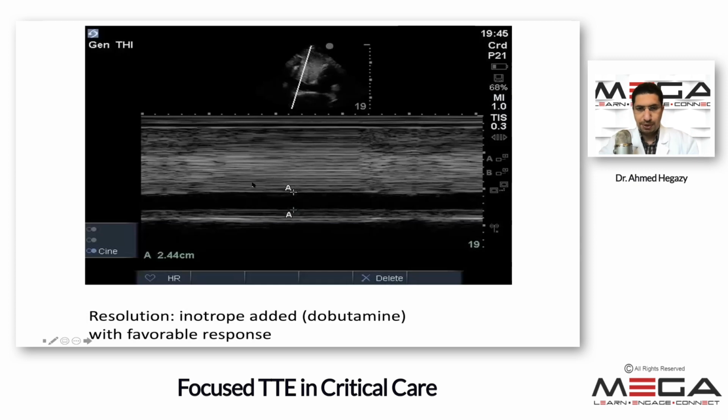So essentially this patient, instead of needing a vasopressor, instead of norepinephrine and vasopressin, needed an inotrope. His contractility was severely impaired. So we added on dobutamine. You could have probably added on milrinone as well. It would have worked just as well. We, in this case, added on dobutamine. And about an hour after adding on dobutamine, we were able to wean norepinephrine and vasopressin to completely off. And the patient was stable on low-dose dobutamine. And we were able, over the next few hours, to also wean dobutamine.